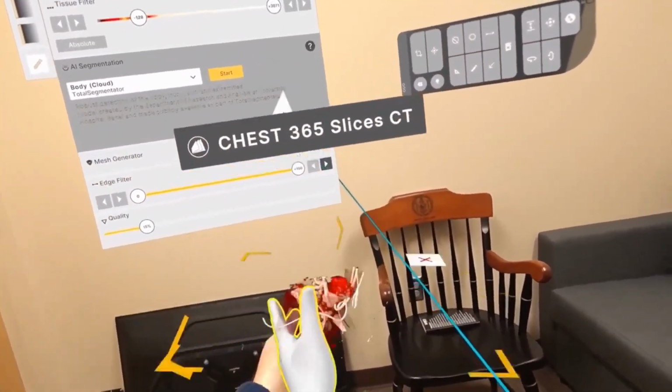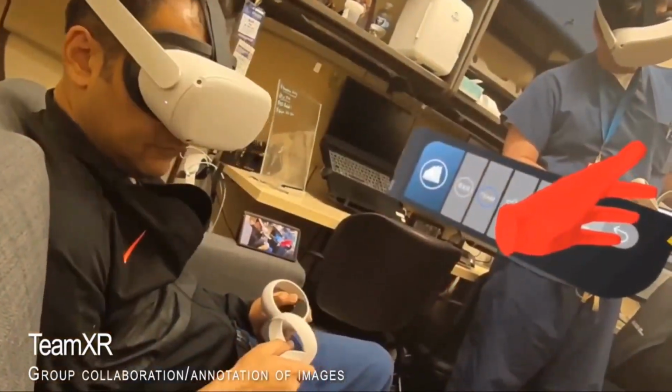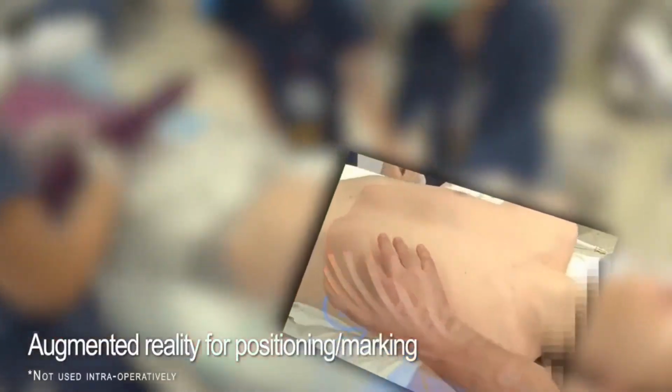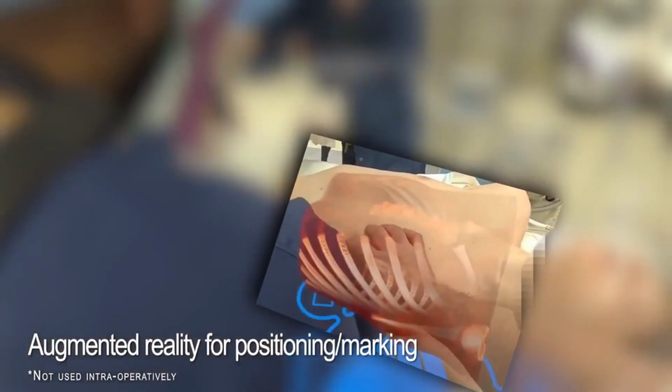The software I use is called Medical Holodeck, and it's pretty straightforward to view these images either by myself or in collaboration with partners. Newer devices like the Quest 3 or the Apple Vision Pro have video pass-through capability, so you can overlay these images directly onto the patient for marking or other preoperative planning.